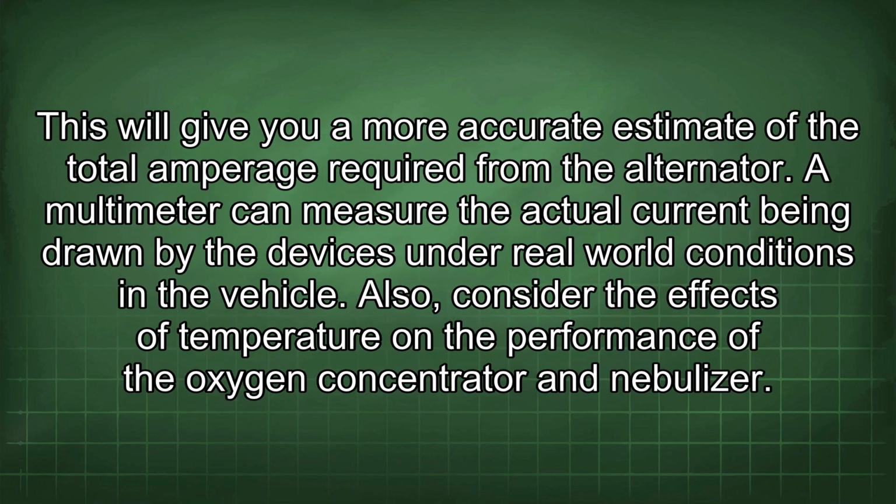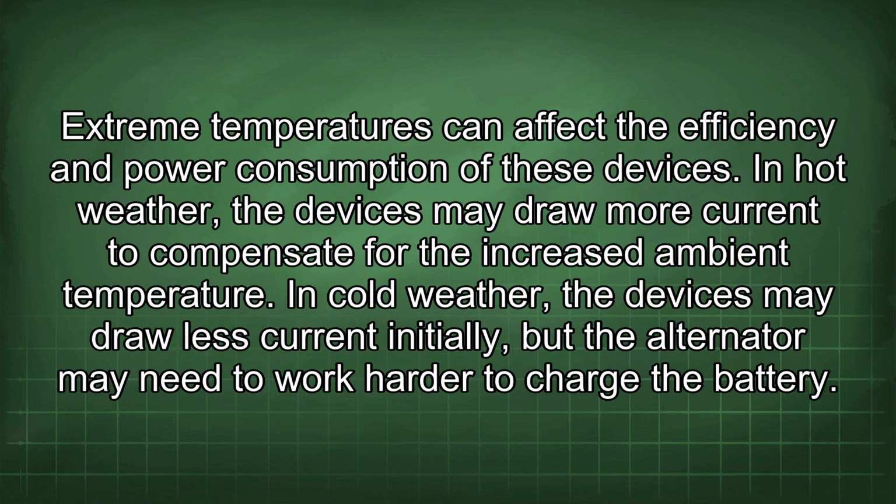This will give you a more accurate estimate of the total amperage required from the alternator. A multimeter can measure the actual current being drawn by the devices under real-world conditions in the vehicle. Also, consider the effects of temperature on the performance of the oxygen concentrator and nebulizer. Extreme temperatures can affect the efficiency and power consumption of these devices.